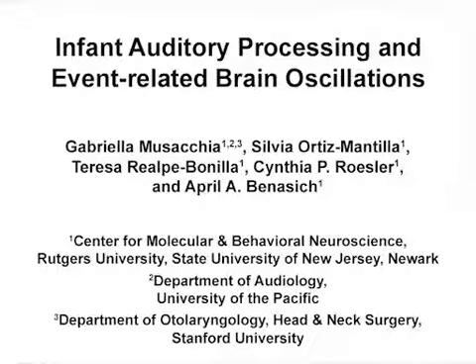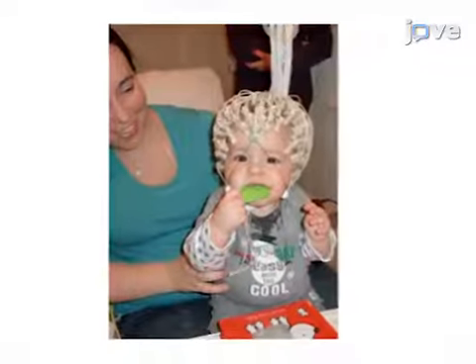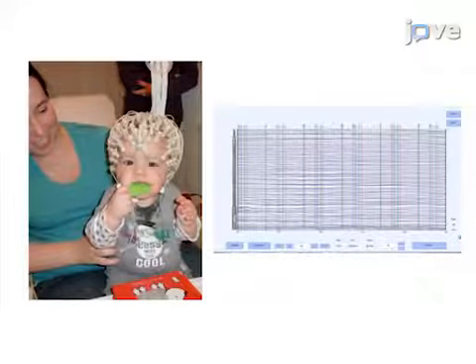The overall goal of this procedure is to estimate the dynamics of neuronal oscillations in infant brain structures over a short timescale. This is accomplished by first applying a high-density sensor net to the infant's head and recording brain waves during stimulus presentation.